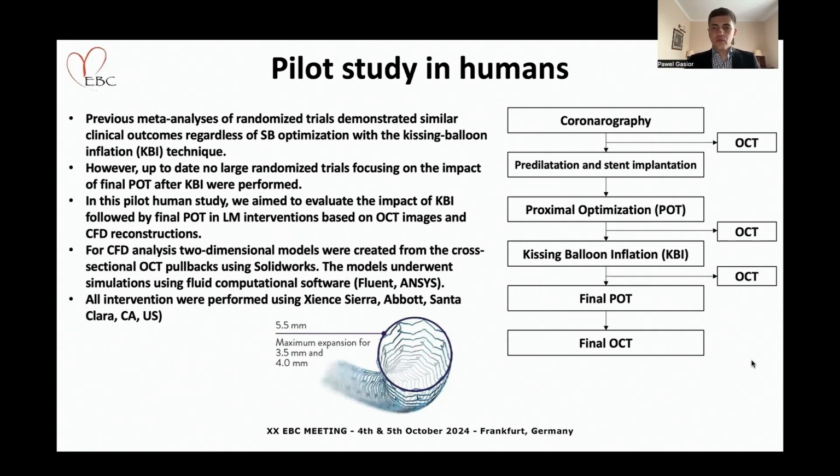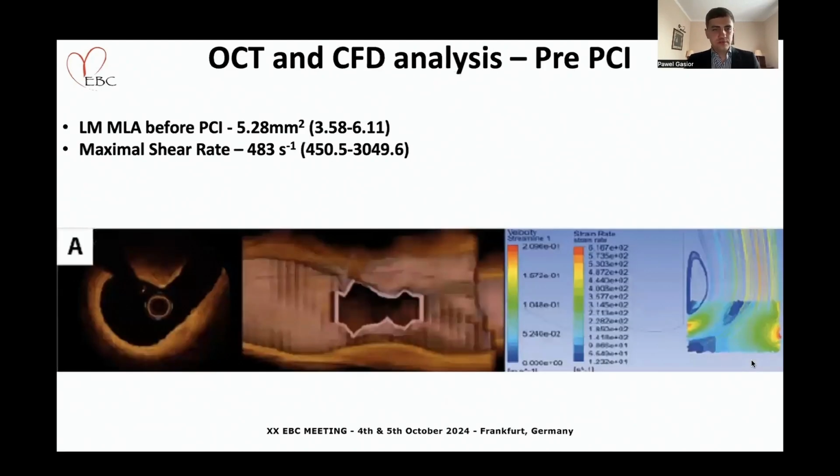Then we performed kissing balloon inflation, after which we again did OCT evaluation, and then we did a routine final POT, after which we performed final OCT evaluation.